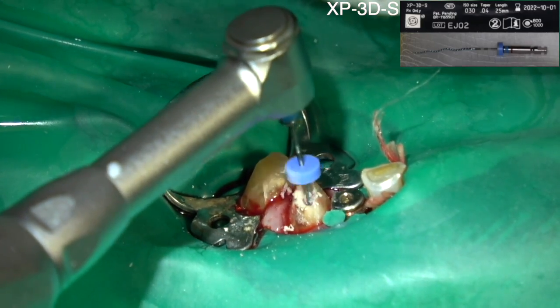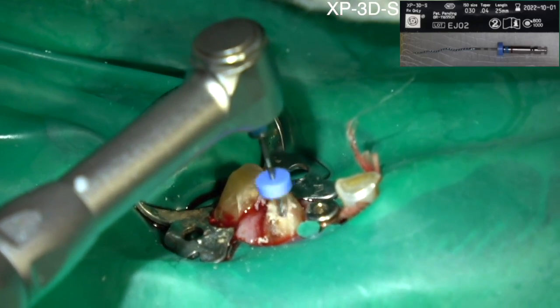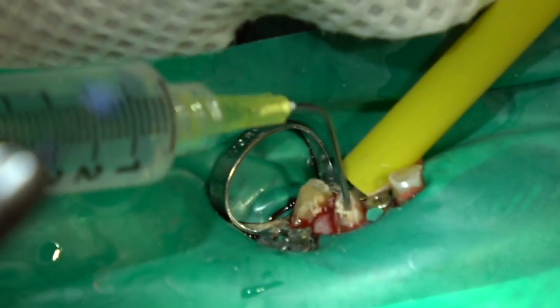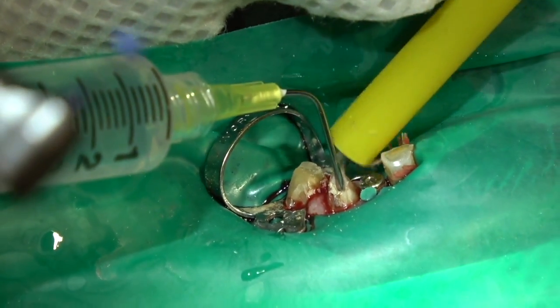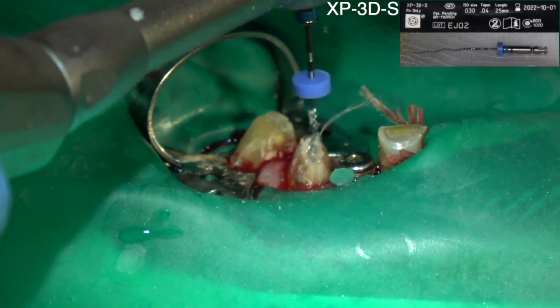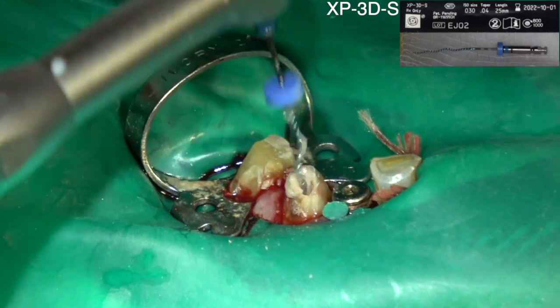You can go either way, and then I'm irrigating with lots of lubrication — the three-to-one water and sodium hypochlorite. A lot of endodontists use straight sodium hypochlorite, but I was taught to use dilute because you don't want a sodium hypochlorite accident where it goes through the apex of the tooth and damages the inferior alveolar nerve.